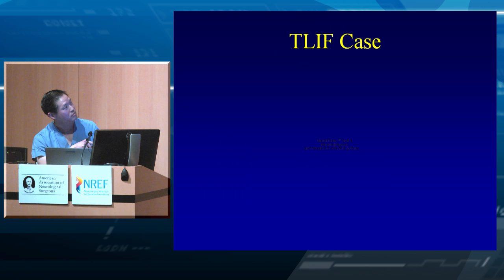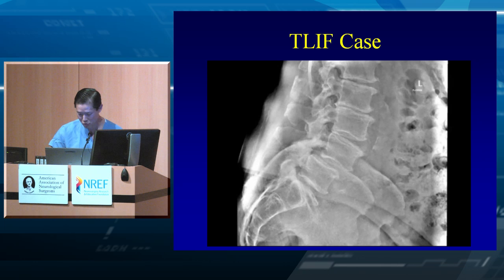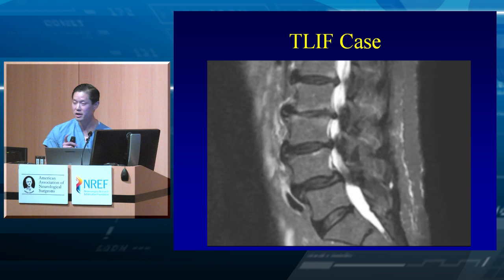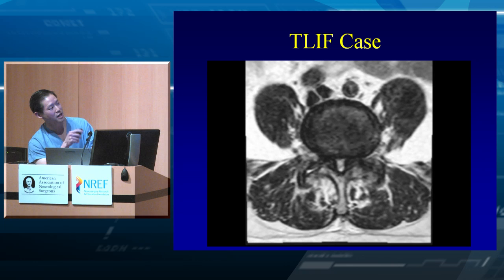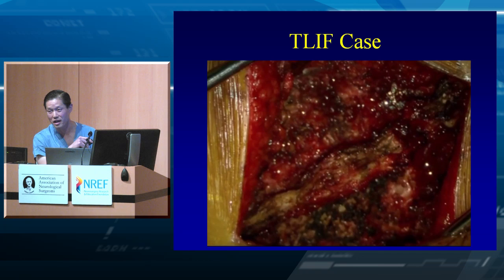So I just have a video, and hopefully it'll run. I think video is always kind of helpful. So this is a patient we did, just grade one spondy, yeah, good grade one. He moves a bit on flexion, and he's got high-grade stenosis associated with it. So this is a TLIF example. It's very versatile. With high-grade stenosis that this patient has, I would typically do a laminectomy with that. So you can see it's very high-grade there. So combined with the laminectomy, it's actually a very straightforward procedure. And actually doing a facetectomy makes the decompression a lot easier, particularly on the side of the facetectomy.